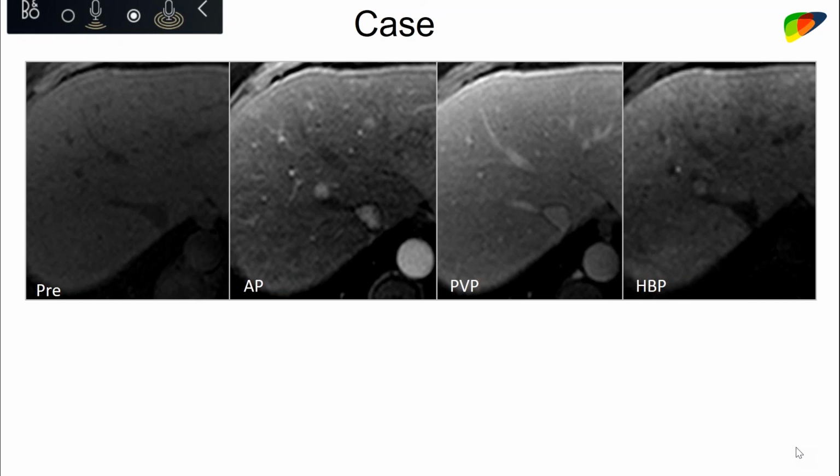It's an imaging feature, and it's interesting, and it's useful. It tells us that it's of hepatocellular origin. You know, no self-respecting metastasis would look like the lesion, or no self-respecting cholangiocarcinoma would look like the lesion that Bill is showing us right now on this particular slide.